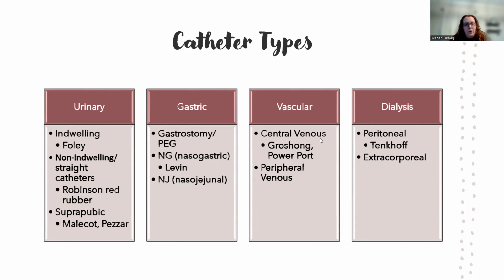All right, vascular catheters. These Groshongs and PowerPorts, geez, are still pretty common.